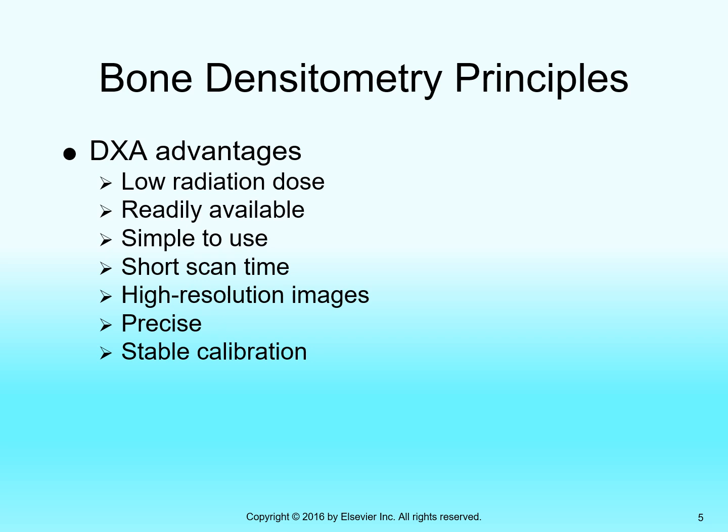Short scan time, it takes less than 5 minutes to perform a bone density test. It is all on projections. Again, we're really not taking images of the bone. It's usually 2 or 3 projections for most protocols. High resolution images, again, the images are not the focus necessarily. Now they are high resolution, the spot images that you get, because the beam is so restricted.